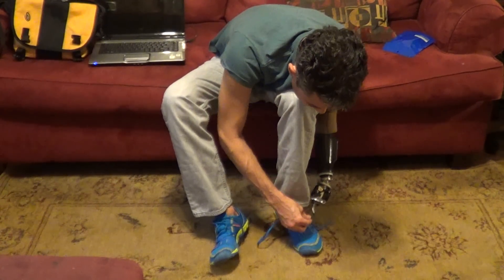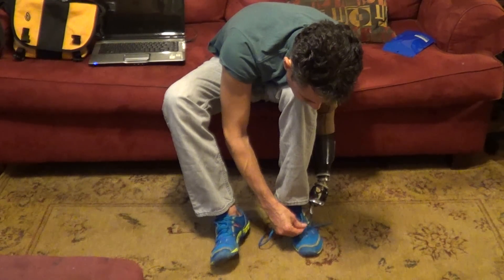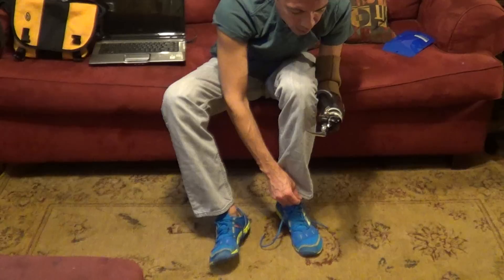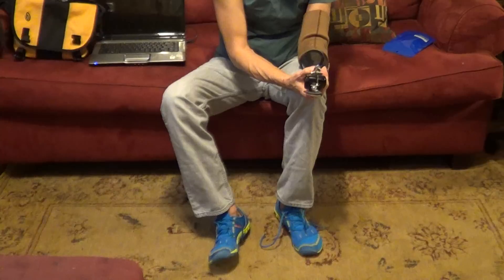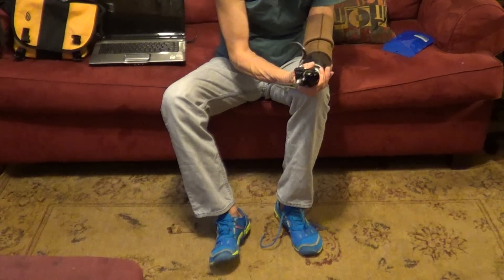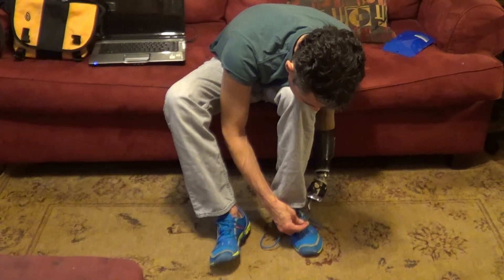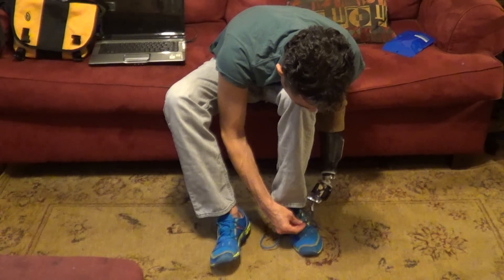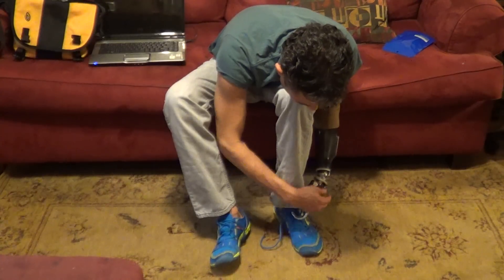Okay, now maybe this next one will go smoother. Close, close. Okay, relax. Open, close, open, close. Undo the flexion. Now relax. Okay, you can do it, Billy. Come on. Close, close, close. There we go.